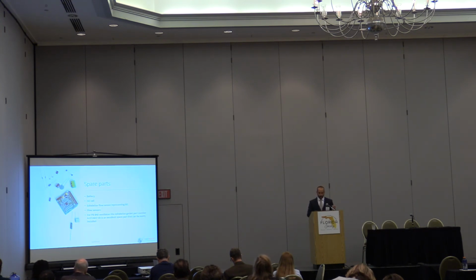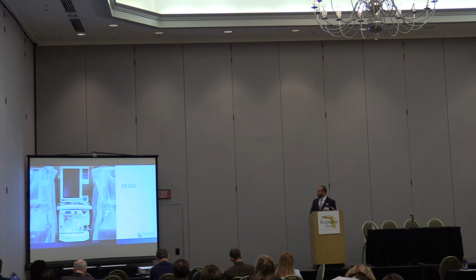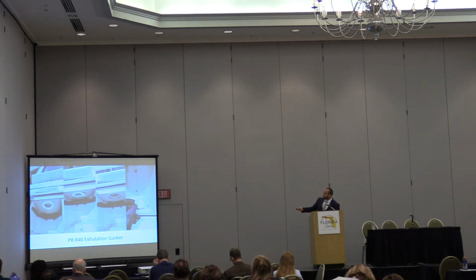So it's an easy piece to get overlooked. Here's a picture of this gasket. What happens is over time it wears out and it no longer creates that airtight seal, or it just falls out.